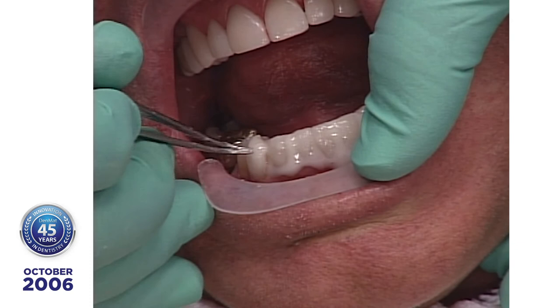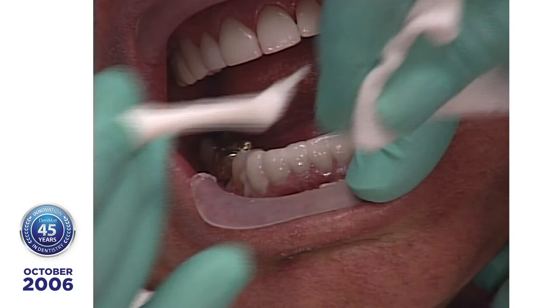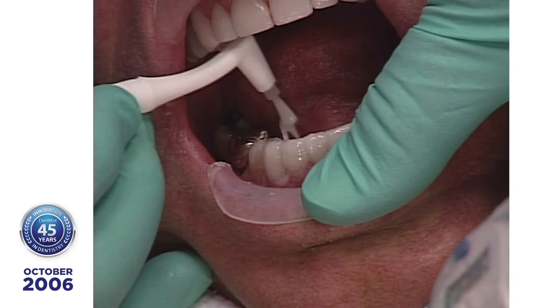Here we go. And I get it going down to the gingival. Now when I take and apply the 2 millimeter tip for 1 second, I'm going to apply it to the gingival. And the reason I am is because I have put it on the incisal and had the gingivals pop out. So that's a little trick.